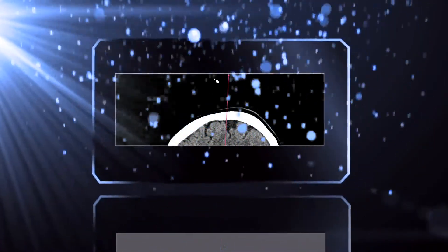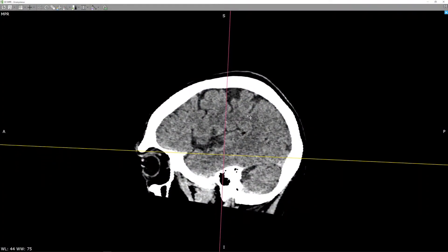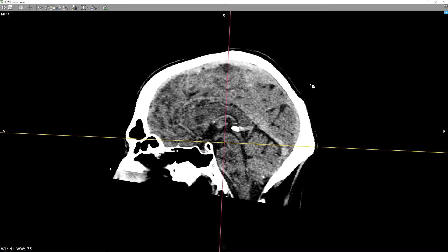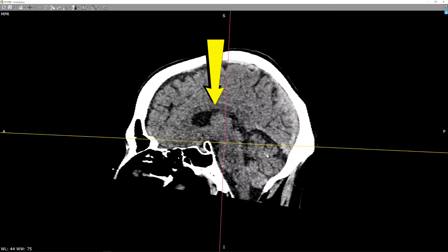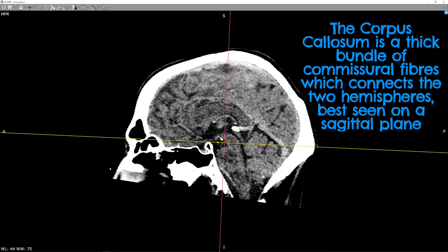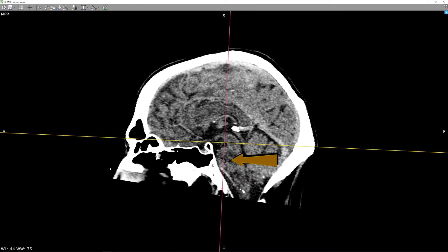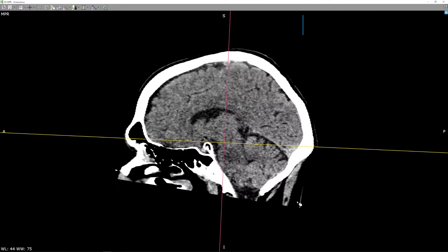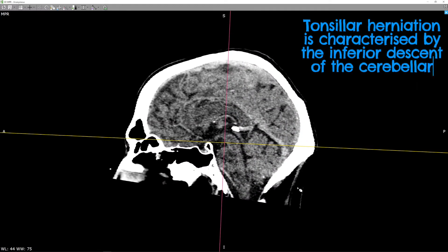The last plane to evaluate is the sagittal plane. It's useful to look at midline structures — for example, the pituitary fossa, the infundibulum or pituitary stalk, the corpus callosum shown here, and the brainstem. Here we have the characteristic shape of the midbrain, pons, and medulla. In addition, we can look at the cerebellar tonsils, which would be seen in an inferior or caudal position if there was any tonsillar herniation in the setting of raised intracranial pressure.